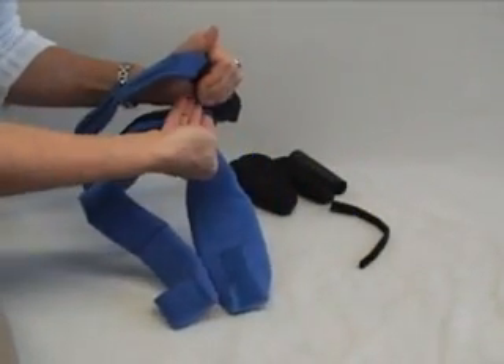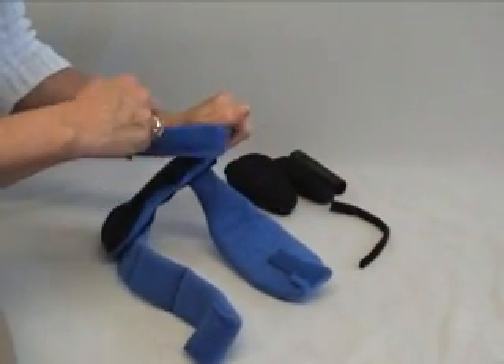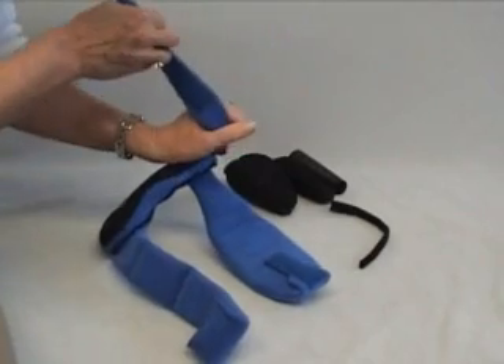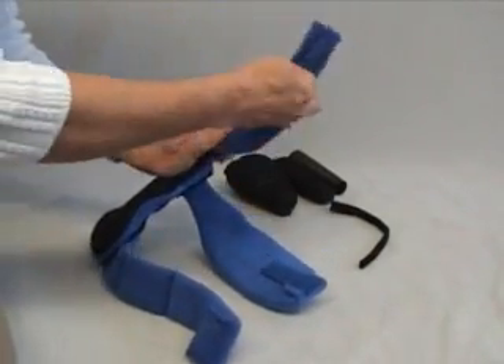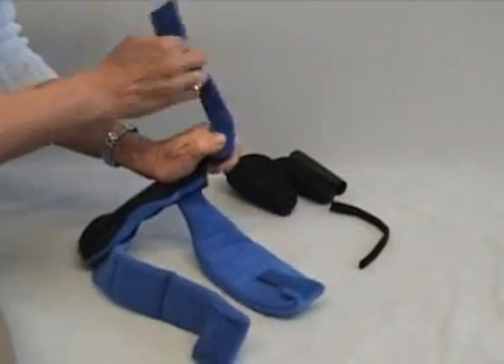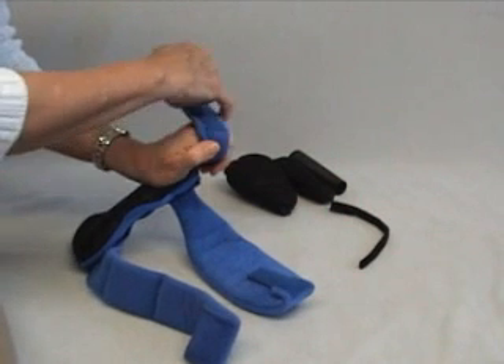We never want to pry open the fingers — that's very, very painful. If the thumb is very severely adducted and you can't pull it around comfortably, try just starting to put a little bit of the material in just to barely start to bring it out.